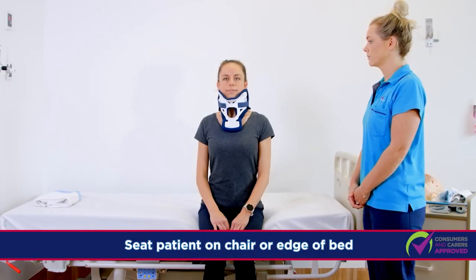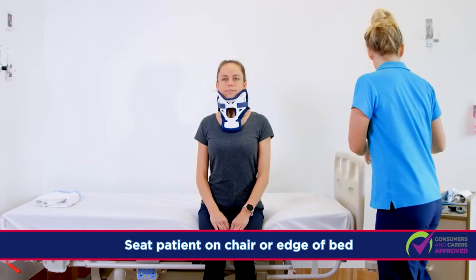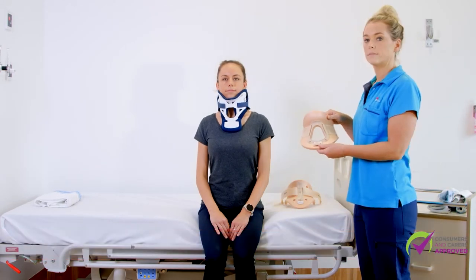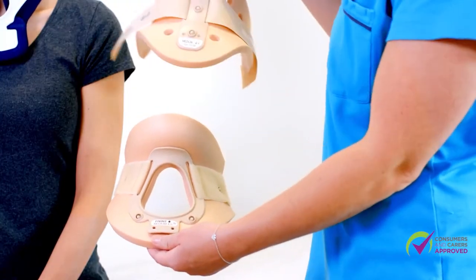Seat the patient on a chair or on the edge of the bed. Have the shower collar next to the patient. This is the front piece. This is the back piece.